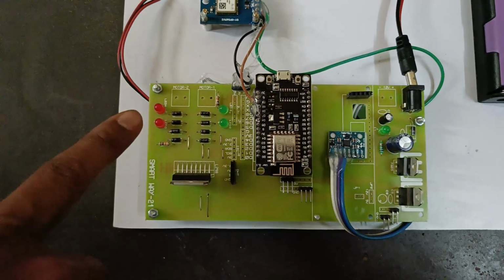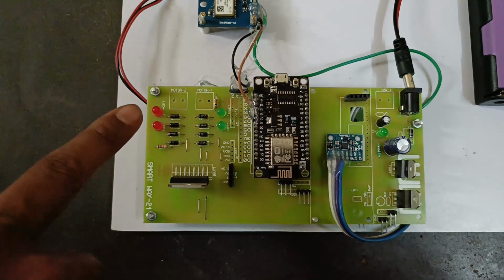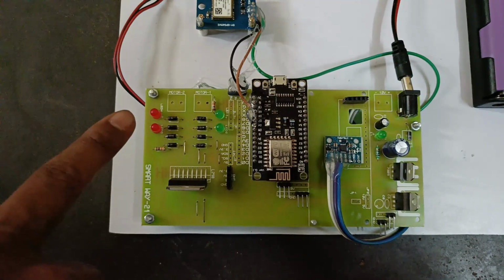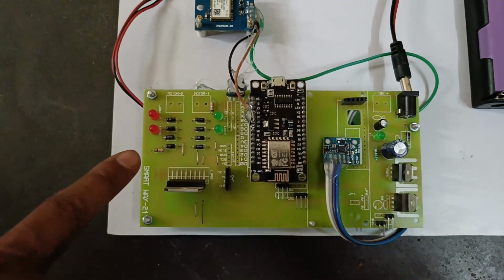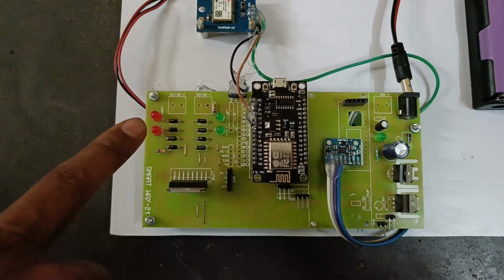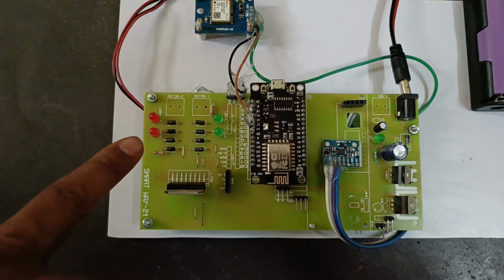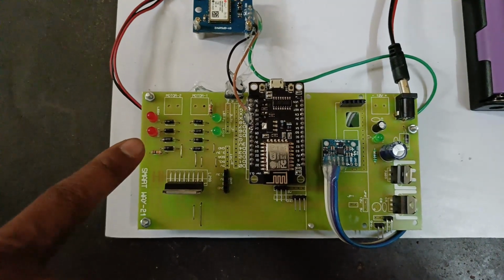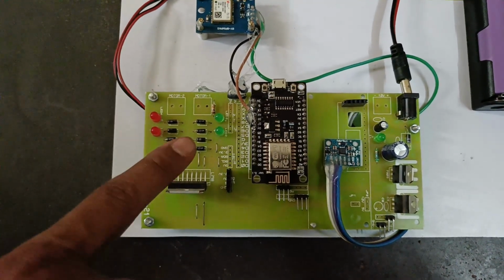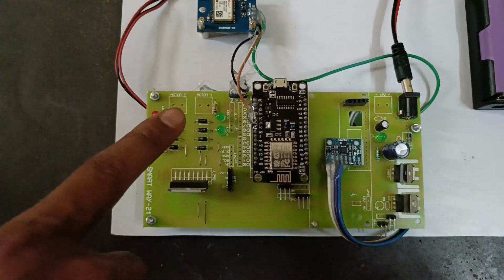In that type of data, the L298N motor driver will rotate the right side wheel backward and the left side wheel forward. While rotating the wheels simultaneously like that, the wheelchair will turn right. Whenever the data is 4, that means a turn left action: the left side wheels will rotate backward and the right side wheel will rotate forward, so the wheelchair will turn left.